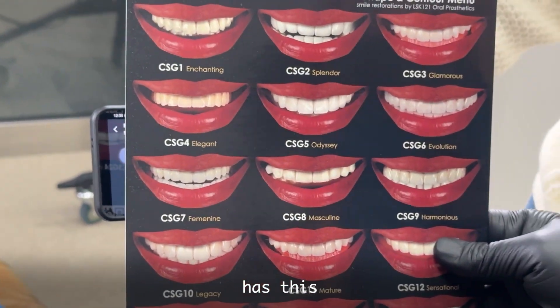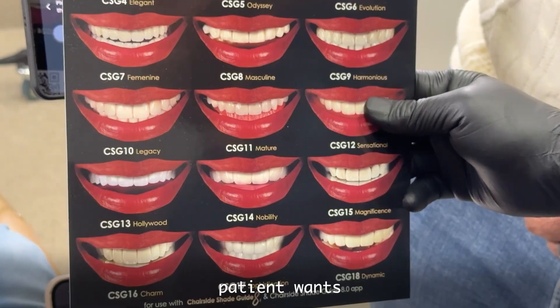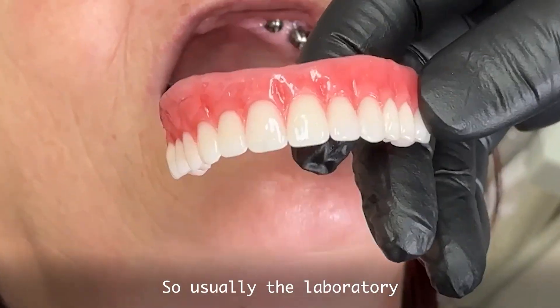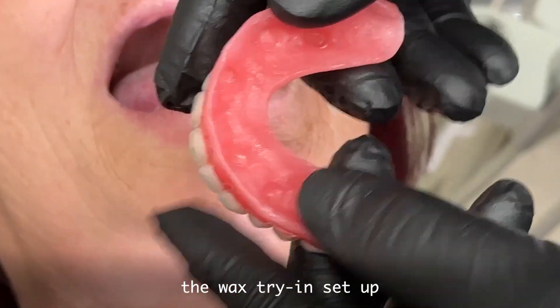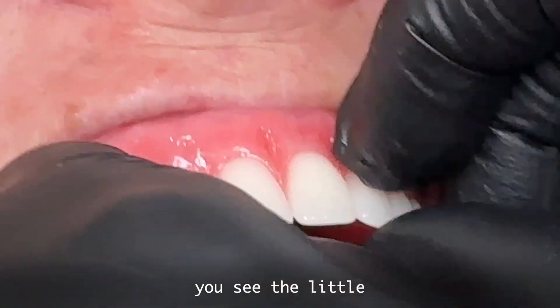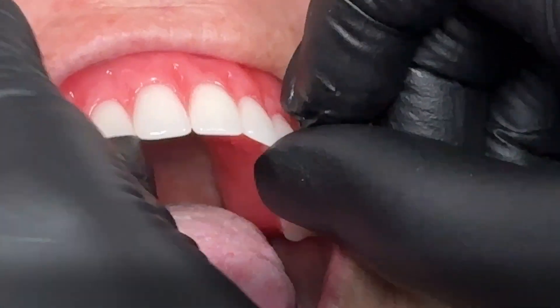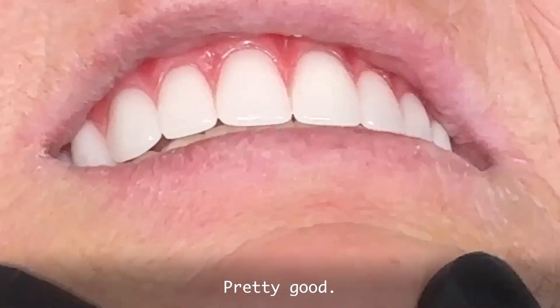The lab has this shade selection so we can design exactly what the patient wants. Usually the laboratory fabricates the wax try and setup. But in this case, we can try this — you see? It's a little bit uncomfortable. Thank you. Pretty good.